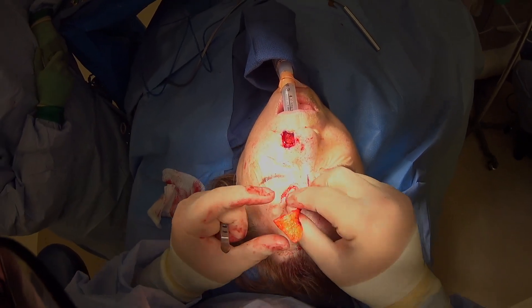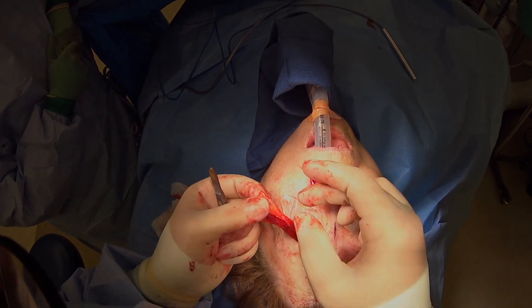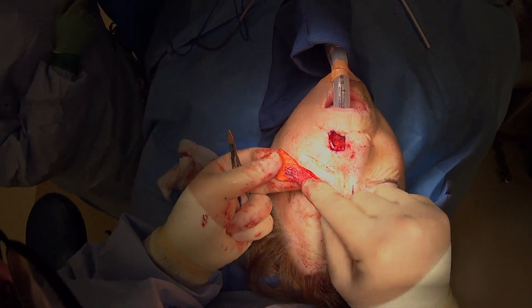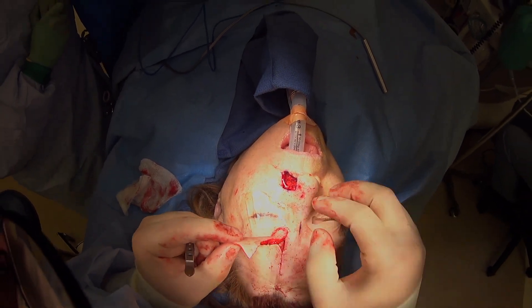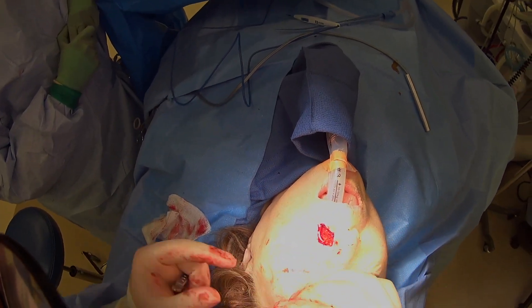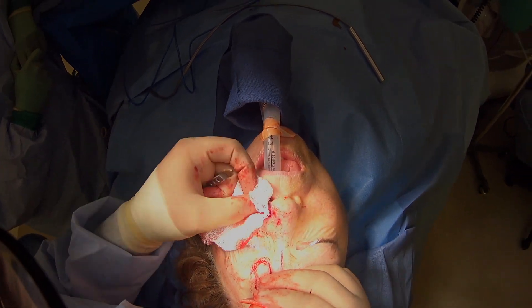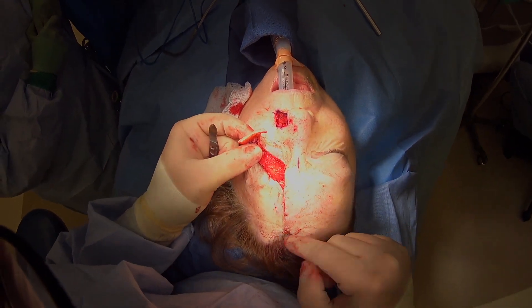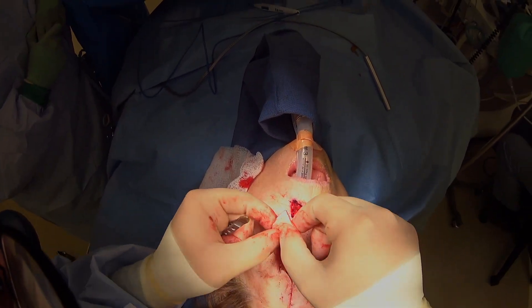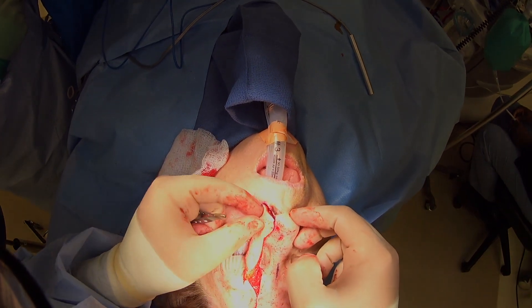Here we are — you can see our forehead flap has a good color to it. We've already done some thinning; you can see where she has the thicker frontalis muscle — we've thinned this about as much as we can, so it'll have a nice smooth even shape like the rest of the nose. We've made some right angles here so we can really inset this and it'll sit nicely with a good contour. The donor site is closed so that'll heal as a nice fine line. Now we're just going to do some fine trimming and start insetting it.